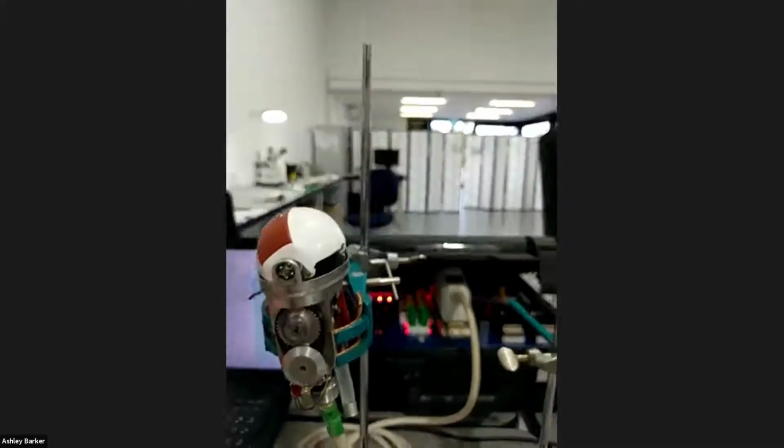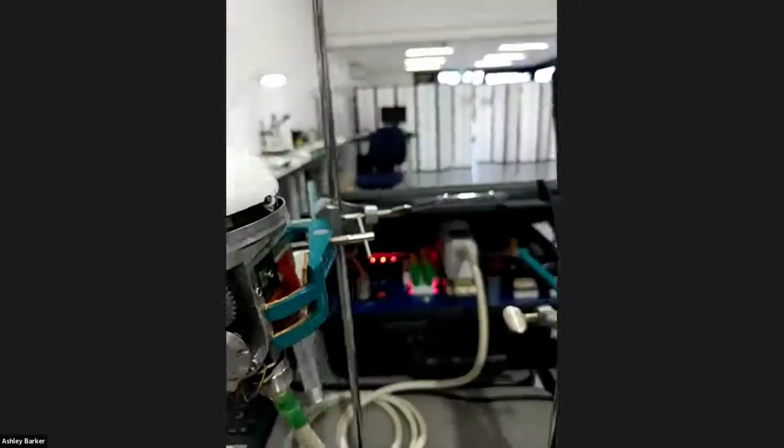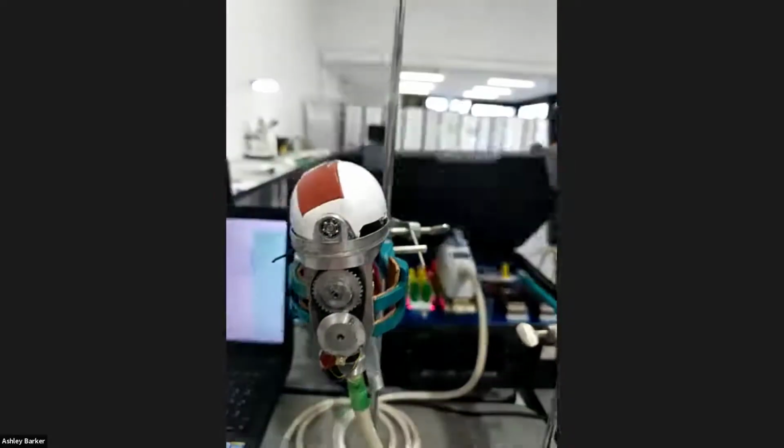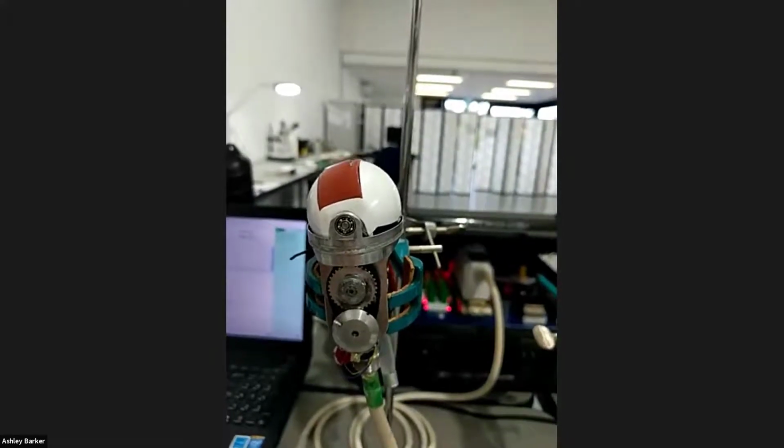It was a mechanical array. Is that right? I'm just searching the old memory banks. To create the image, they used to manually drive it so that they just point it backwards and forwards. So this is a RAB 48, which is probably the most common probe out there used by baby scanning people at the moment.